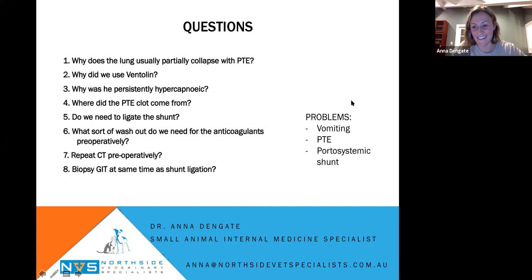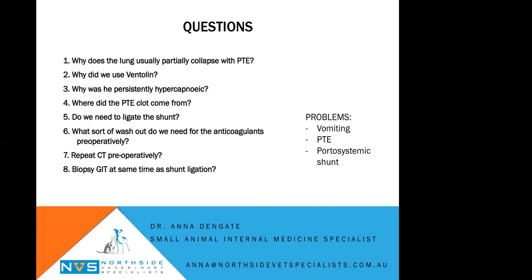Hey guys, interesting discussion. My only comment would be that shunts are generally a result of increased blood flow, and so in most cases where we see shunt, the shunting blood flow is preferential to the path of normal flow, i.e. through the portal vein, and that tends to be why they stay open. And so in the cases of shunts like this, or multiple acquired shunts and so forth, we don't typically expect to see sluggish blood flow. So even these phrenicogastric shunts, even though they're up against the diaphragm, we don't typically expect to see slowed blood flow when compared to the normal portal vein. It should be of a similar velocity or even increased.